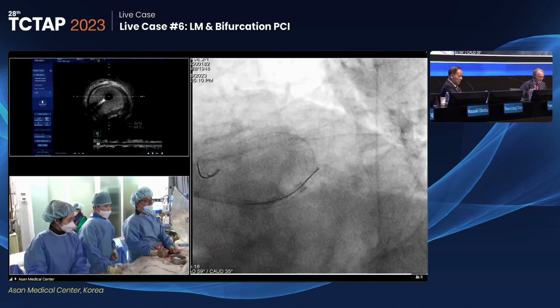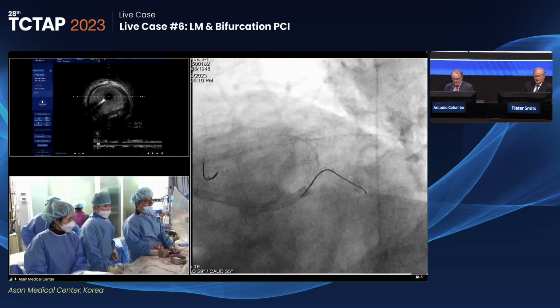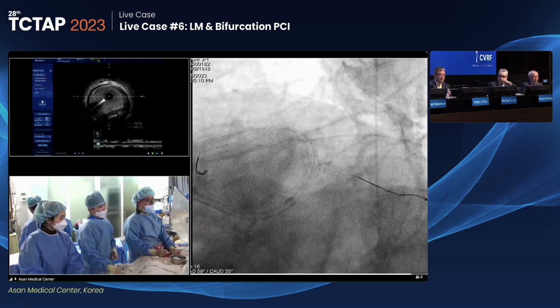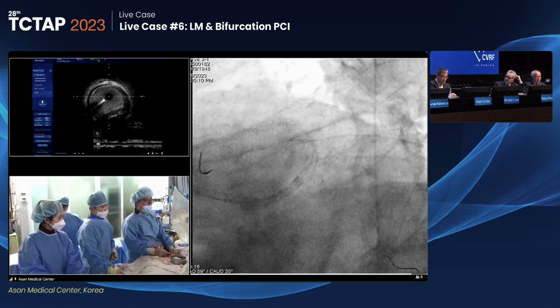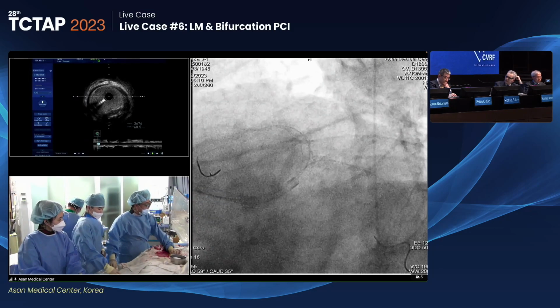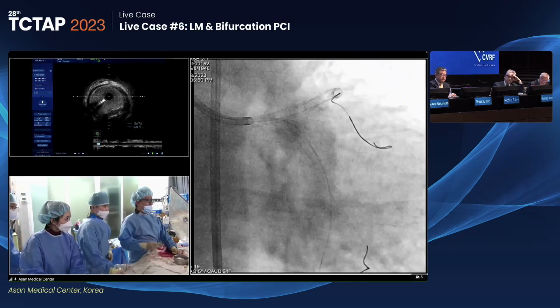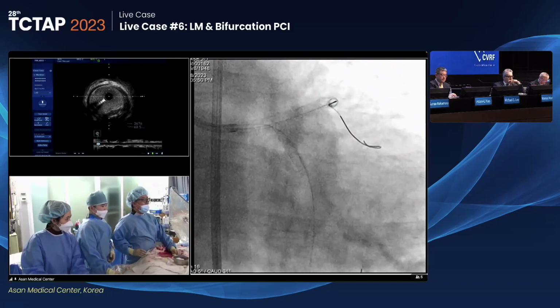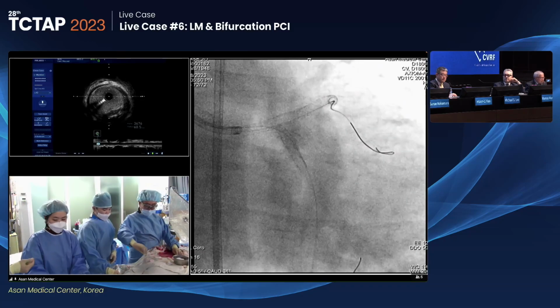Yes, we don't usually do the POT. But how can you be confident that your wire is in the middle of your stent and not outside of it? Yeah, so that is one of the important issues. Professor Shao-Liang prefers proximal part wiring, and we usually use the middle, and the distal part would be okay. Looking at this moment, and in the past, Professor Shao-Liang's preferred position is the proximal part. And the Choice PT.